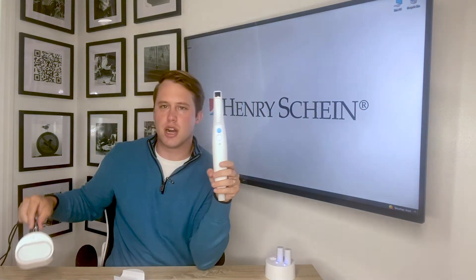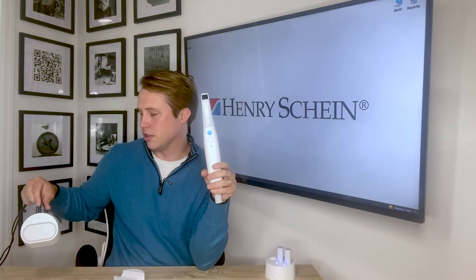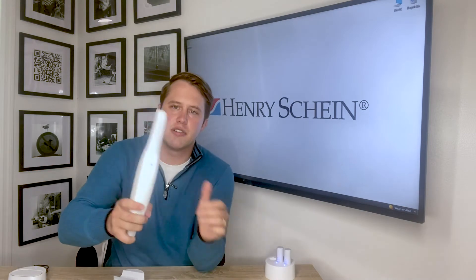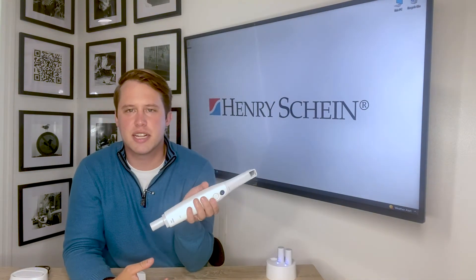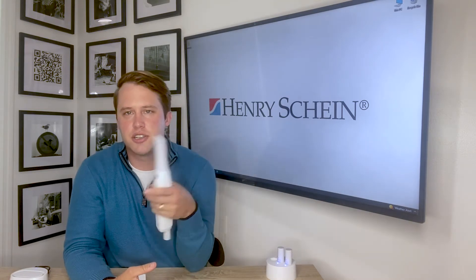Make sure your wireless hub is plugged in and blinking blue. Then power the unit on by pressing for about two seconds, and wait about 10 seconds for the scanner to connect to the wireless hub.